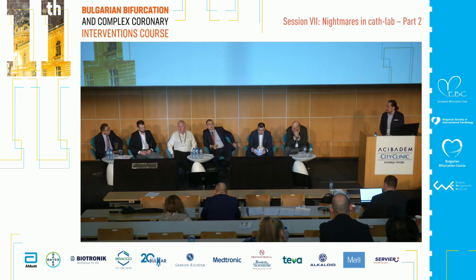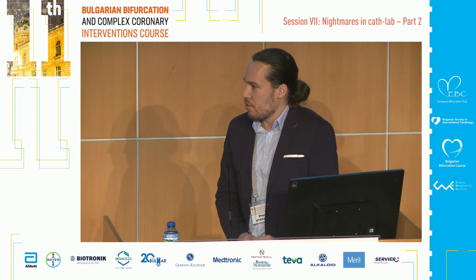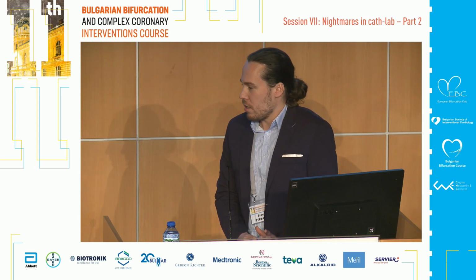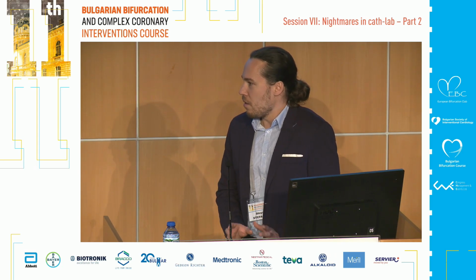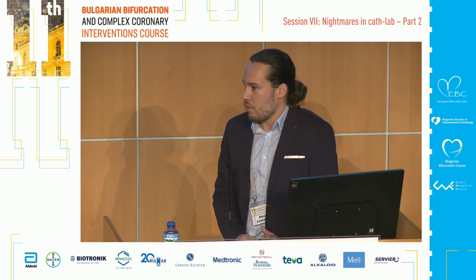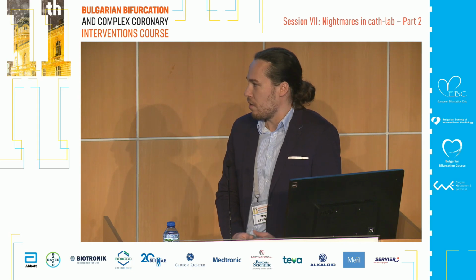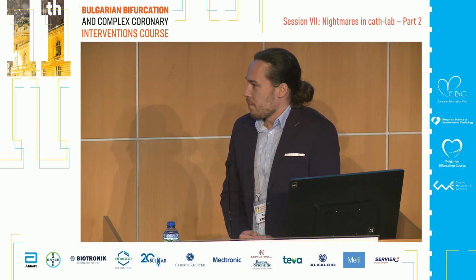Yeah, this is the point. Could you, just the last question, find other cases published in the literature? I searched and actually I couldn't find exactly that type of case. There are isolated cases where colleagues are using duct occluders or other types of occluder, but not exactly this type of vascular plug. So there are maybe 2 or 3 other cases, but with different devices. So this shows we have to take every patient personalized and see which type of device is the best in every case. How long is follow-up right now, up to now?